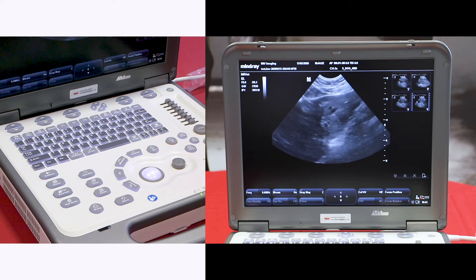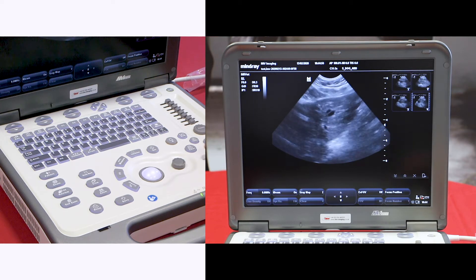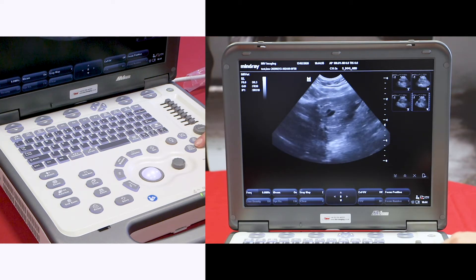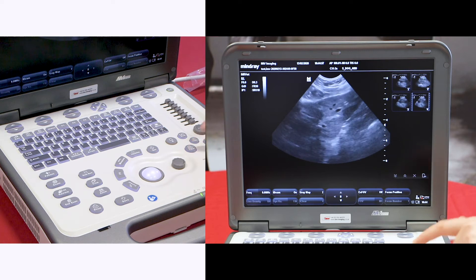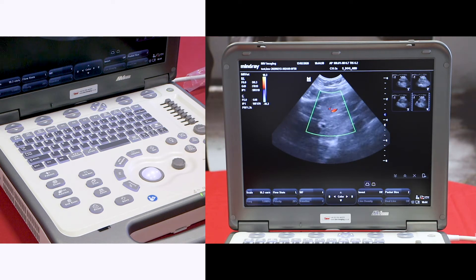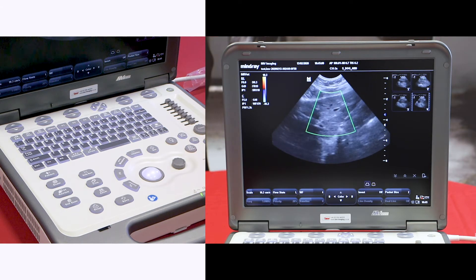We have various colour options. The first is a colour doppler. Press colour and a region of interest box will appear.